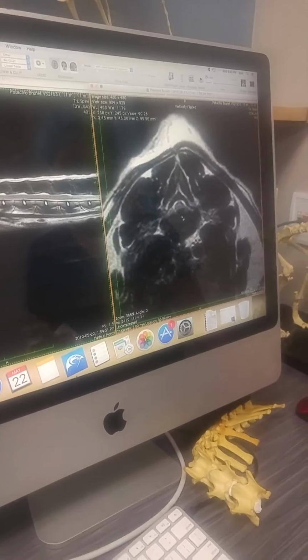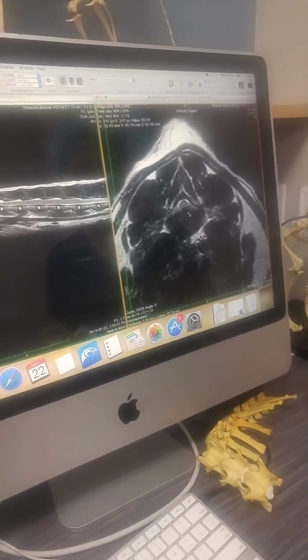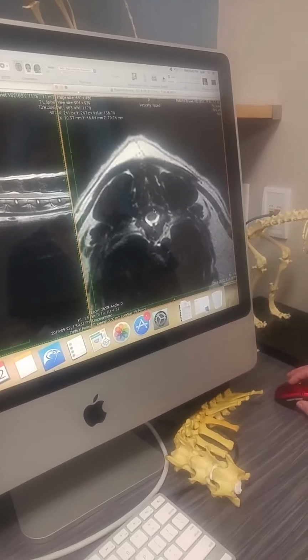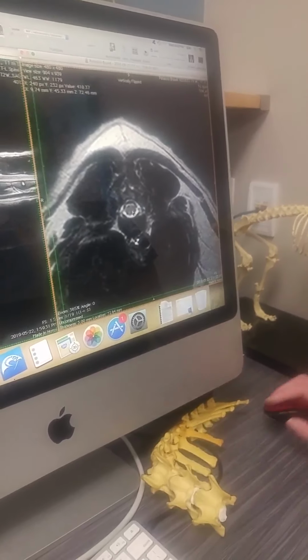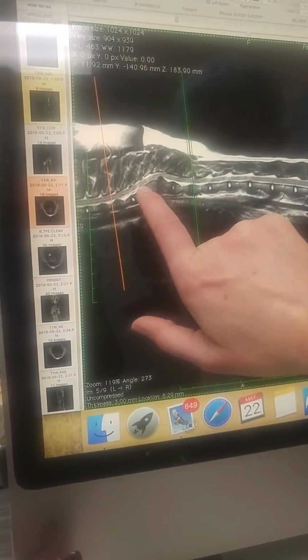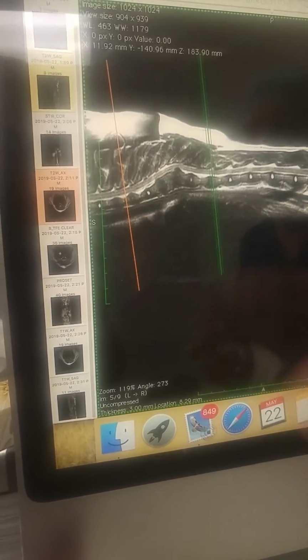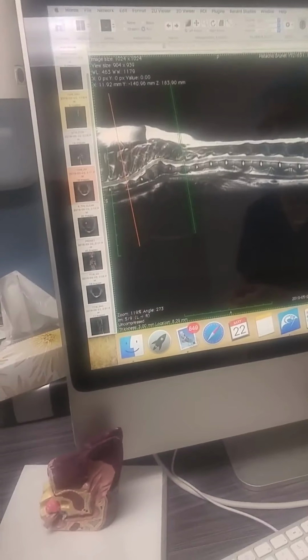And we can see, oh yeah, here is the most compressed one, really, and we can also see that in the middle, the color itself. So if you look at this bit and then that bit, there is a tiny bit more white. That can be from the compression, a little bit of swelling. Okay, if that makes sense. Is that where you would have thought the pain was?